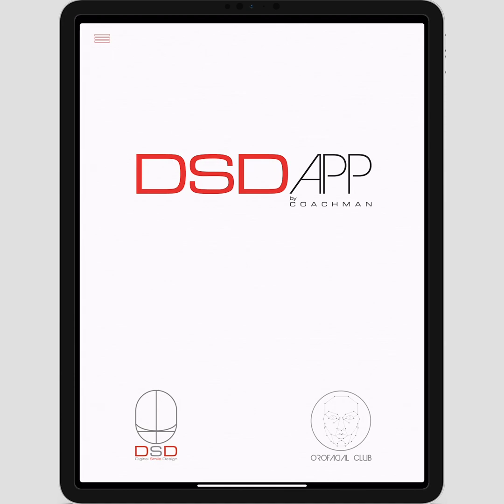First, I want to congratulate you for being interested in getting a full understanding of our app. I want to make sure that you master your digital smile design because, as a dentist myself, I understand the value of better communicating with your patients and your team members, along with creating beautiful facially-driven smile designs.